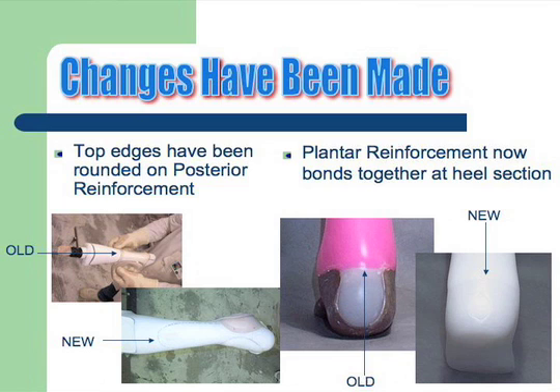In our old devices we used to leave a gap at the back — we've eliminated that. It's a radius now, and we bring the plantar reinforcement and wrap it right around the entire device.